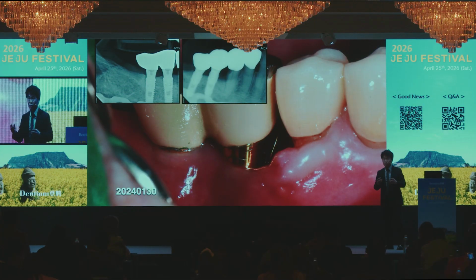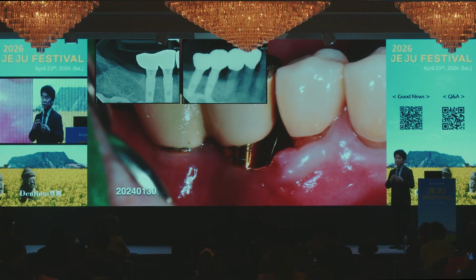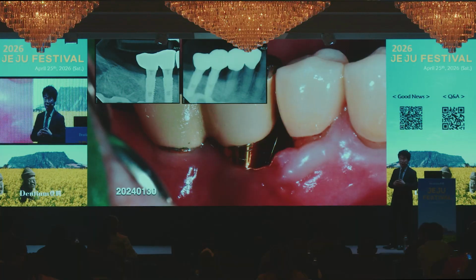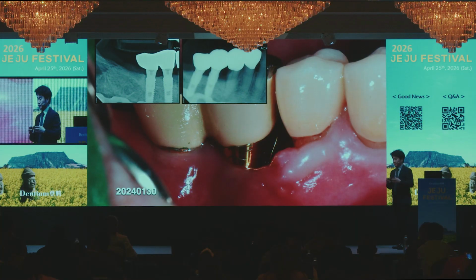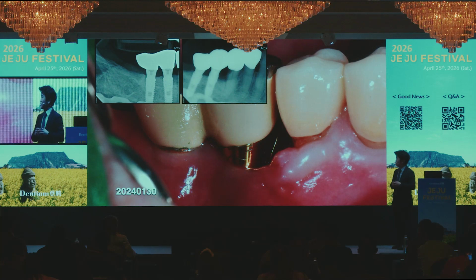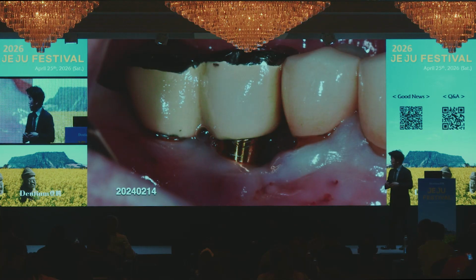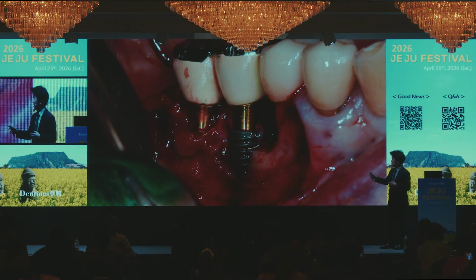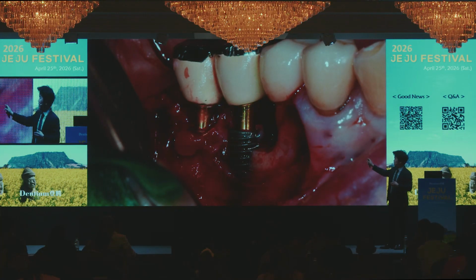She suffered from difficult access for brushing and food impaction. Also, a secondary caries was involved, about the food impaction too. So I recommended the surgery. She accepted. The full thickness flap easily showed an unfavorable bone defect.